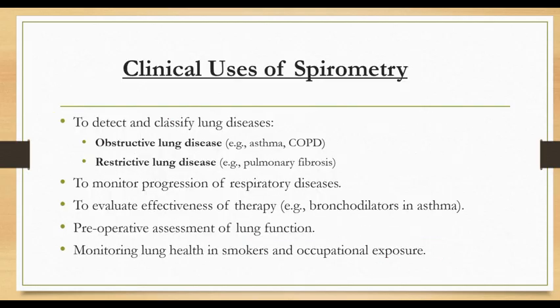Uses of spirometry. It is used to detect and classify lung disease. Obstructive lung disease, for example asthma and COPD. Restrictive lung disease, for example pulmonary fibrosis. It is also used to monitor progress of respiratory disease and to evaluate effectiveness of a therapy, for example bronchodilator in asthma.